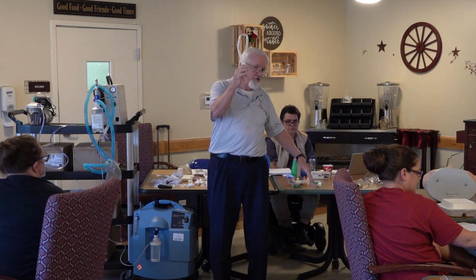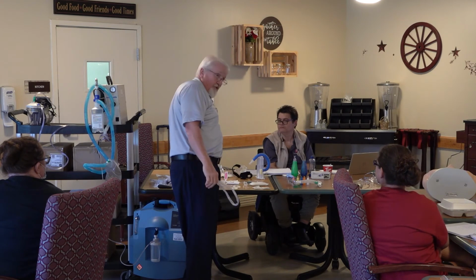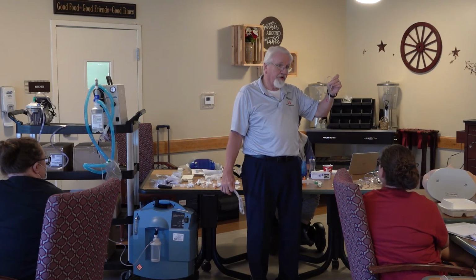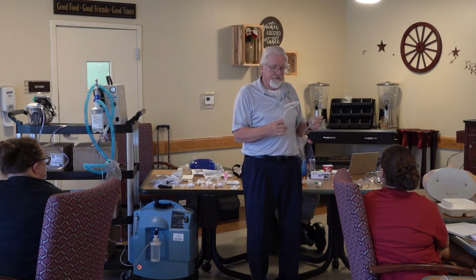Financially, it makes sense. If I suction Bob 4 times in the day, I've already paid for 2 of these. If I'm doing the single use correctly and throwing it away each time, where I've had to open 4 of these in a 24-hour period, I've paid for 2 of these.